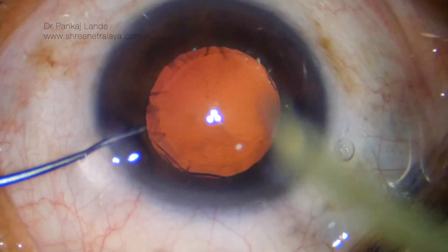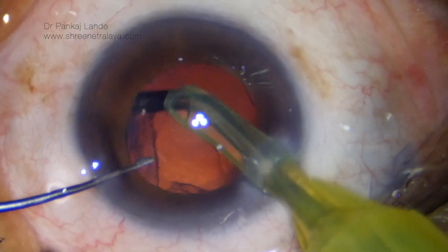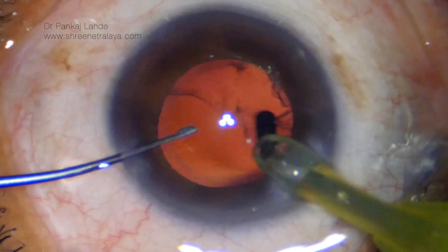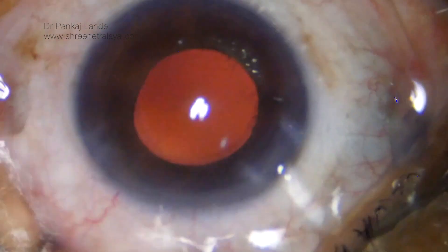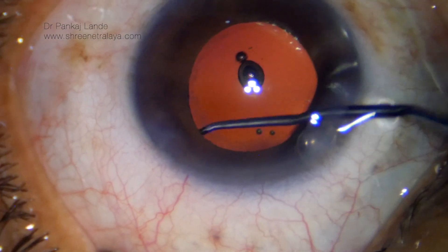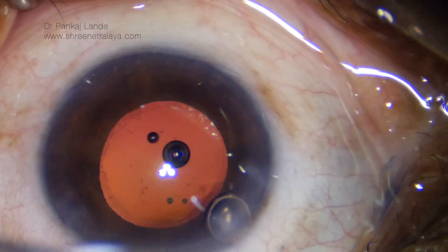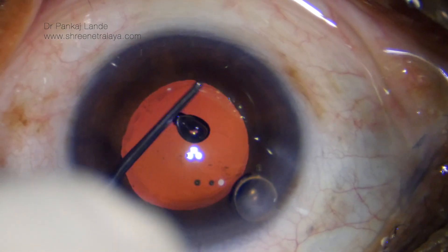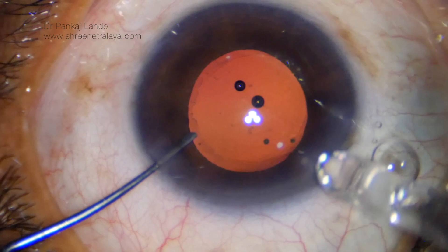Though beginners can do this with the help of the IA probe itself. The AC is filled with viscoelastic and I am using a coaxial IA cannula to remove the cortical material, starting from the sub-incisional cortex. A sweeping movement side to side makes it easy to remove all the cortex very nicely. This is followed by anterior capsule polishing with the help of Swingers anterior capsule polisher.